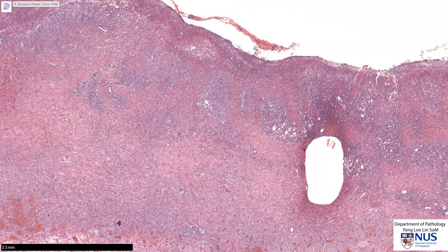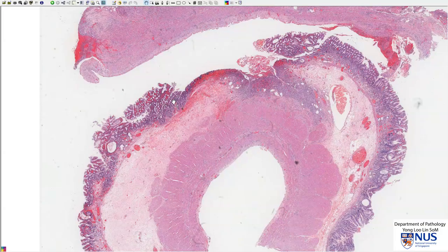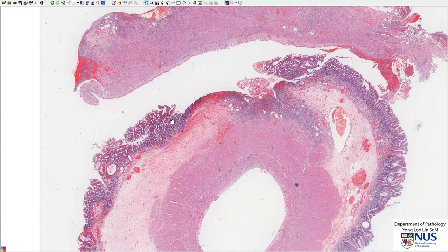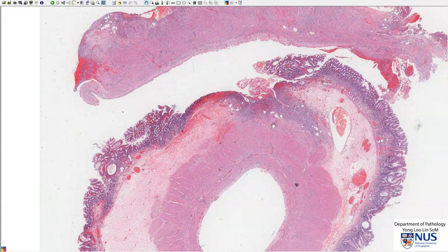Let me show you another example which is less deep. This is another example of a chronic peptic ulcer. Again, we have the intact mucosa on both sides, and this is the base of the ulcer. This thick pink layer here is the muscularis propria, and we can see that this ulcer only goes into the submucosa and a little bit into the muscularis propria — so this is a more shallow ulcer.